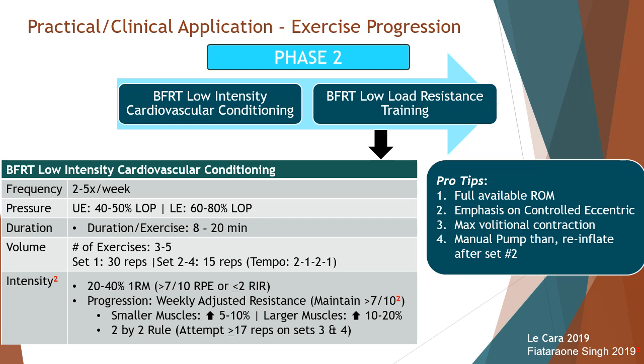If you're using a manual pump, that's often common with a direct-to-consumer rather than the industrial-based units, then you want to reinflate after set number 2, because oftentimes with the contraction and the relaxation of the muscle during the active exercise you can lose pressure.